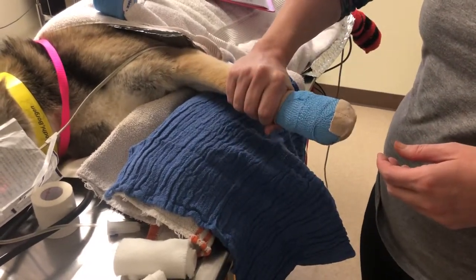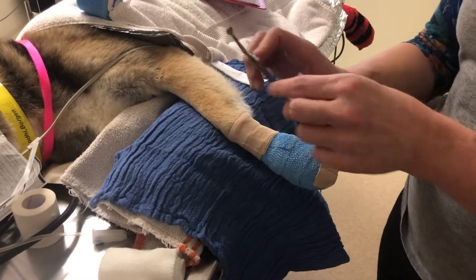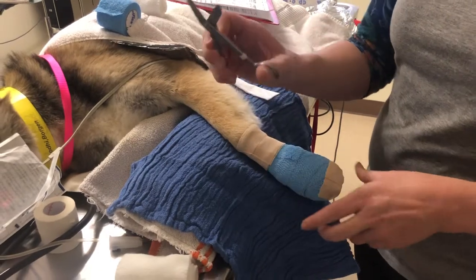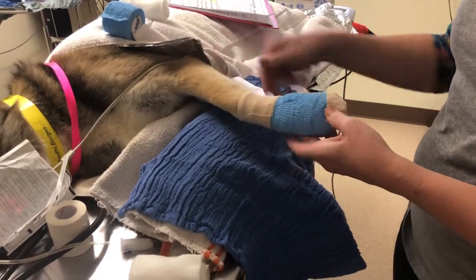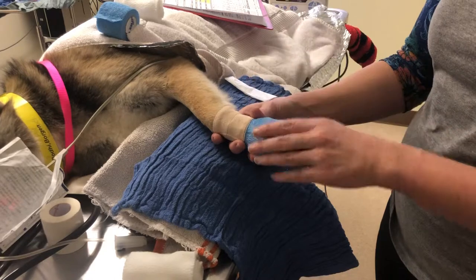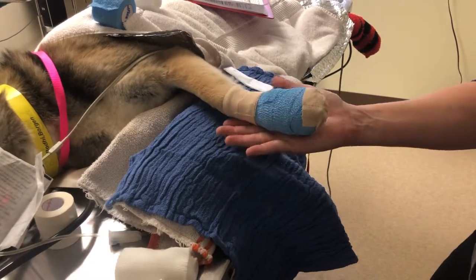When taking this bandage off, you can just completely unravel it without cutting. If you do cut it, use actual bandage scissors with a guard so you don't cut his skin or the sutures. I'd like this bandage replaced daily, or sooner if there's strikethrough — red coming through — or if it gets wet or dirty.